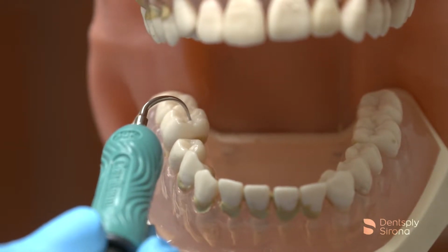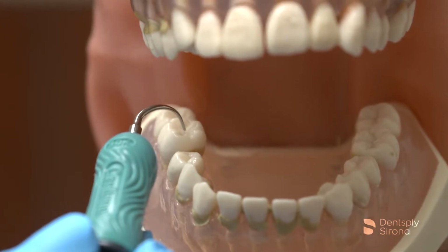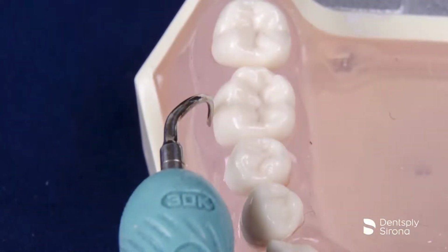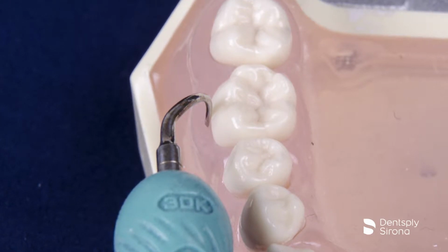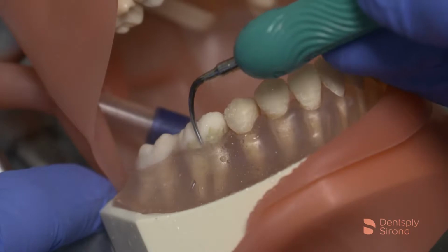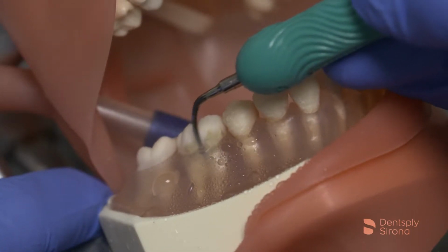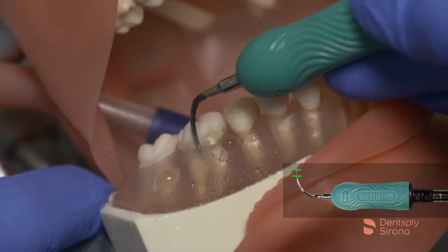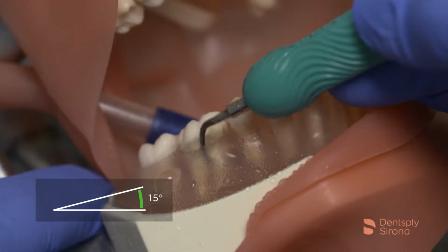After this is established, maintain a vertical approach and notice that the back of the insert is adapted to the surface you are entering. Utilization of all surfaces is indicated for proper adaptation in periodontal pockets interproximally. Begin on the clinical crown, float subgingivally, riding the anatomy and clinging to the pellicle while always maintaining 2 to 3 millimeters of adaptation and no more than 15 degrees angulation.